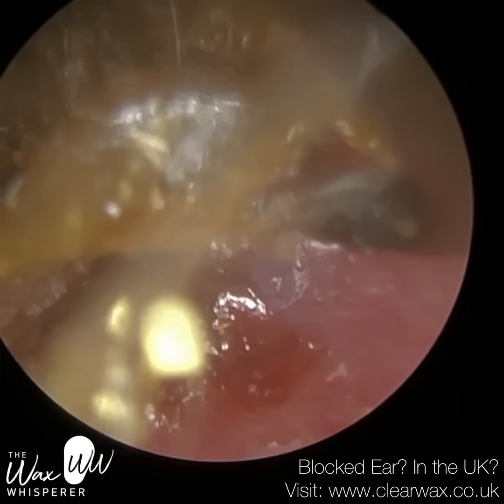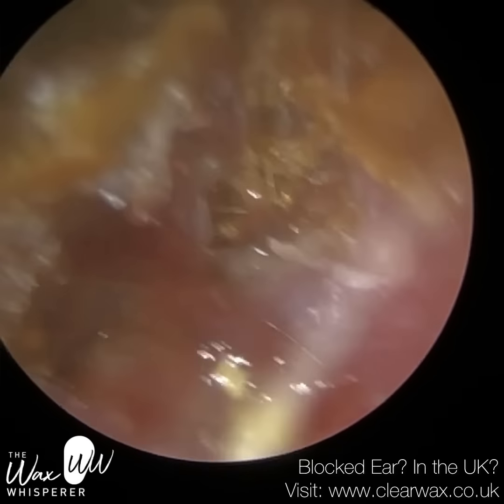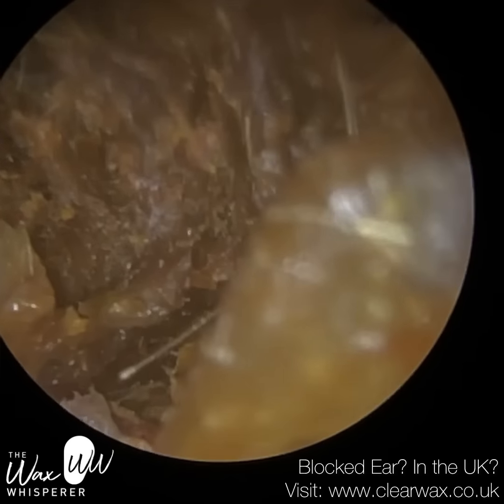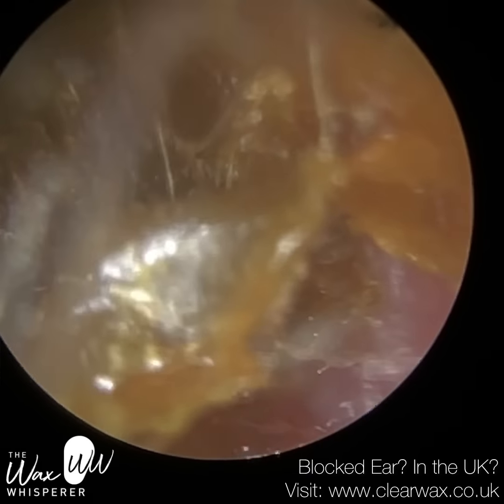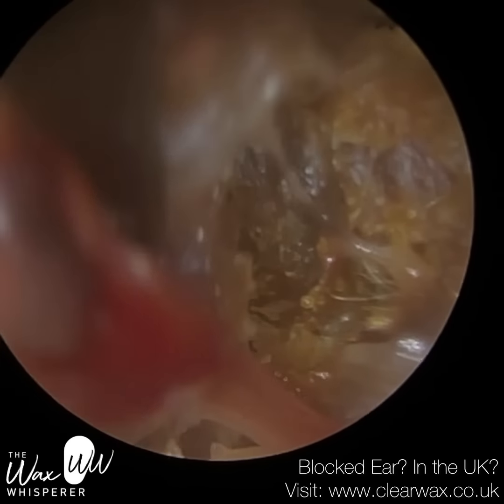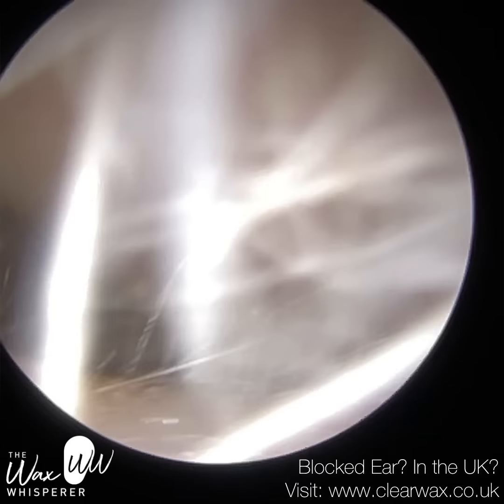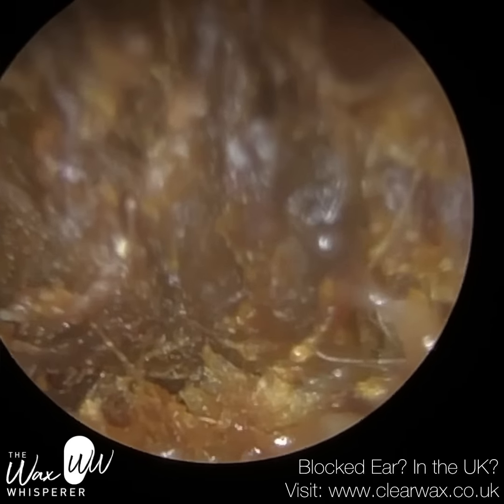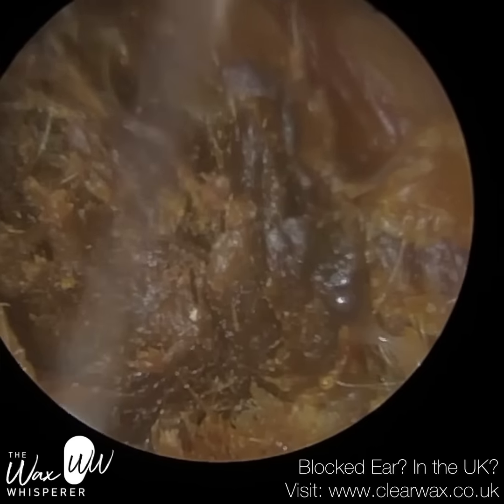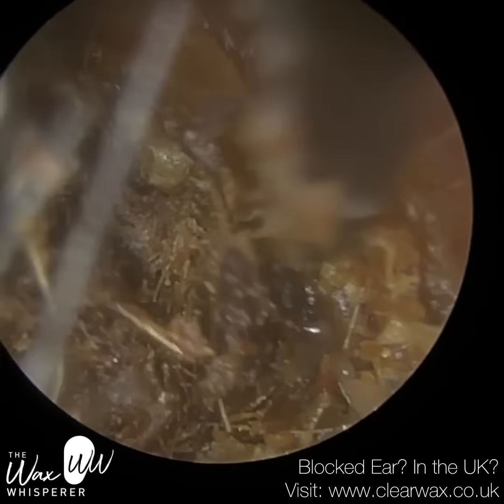So this skin was compressed, adhered to the canal wall, and as we released it, you can see some inflammatory tissue there, granulation tissue. And the ear pick, because of the little angled tip to it, really allowed me to glide in between the keratin plug and the canal walls without the tip of the ear pick coming in direct contact, because obviously that would be very painful. It's like a needle in your ear and you're poking it against the side of the ear canal. So that worked very well indeed.